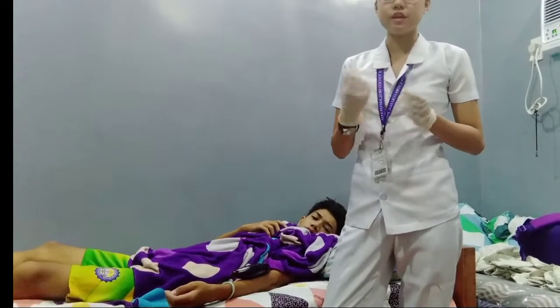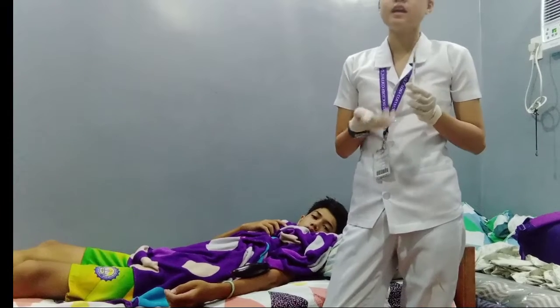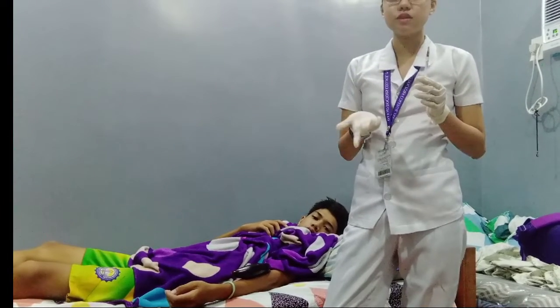Afterwards, we need to hold the needle very close to the patient's skin. Insert it slowly at a 5 to 15 degree angle until you feel resistance. Advance the needle through the epidermis about 3 millimeters.